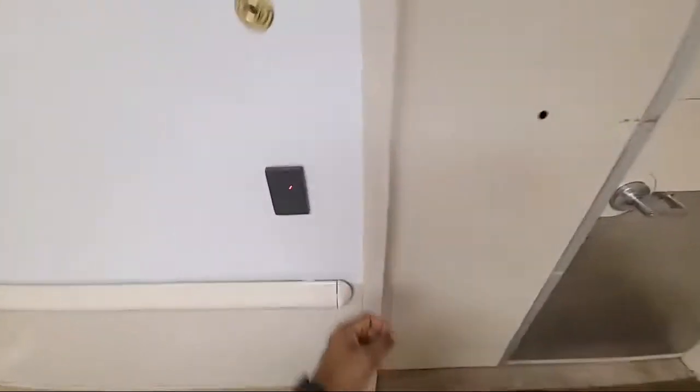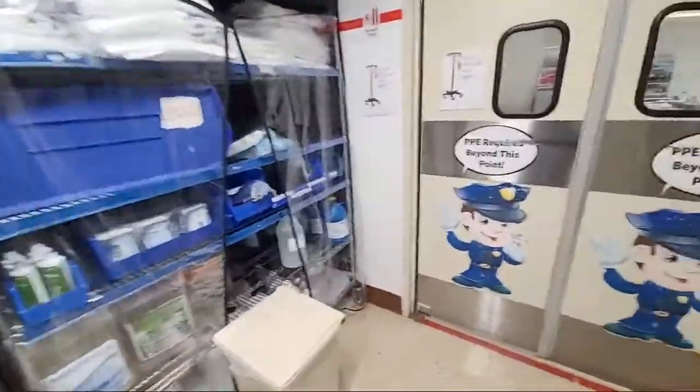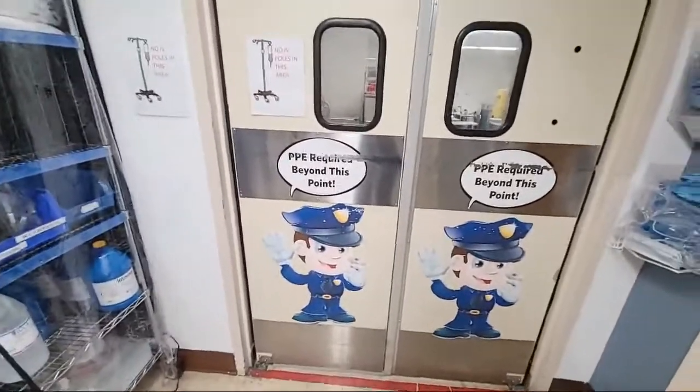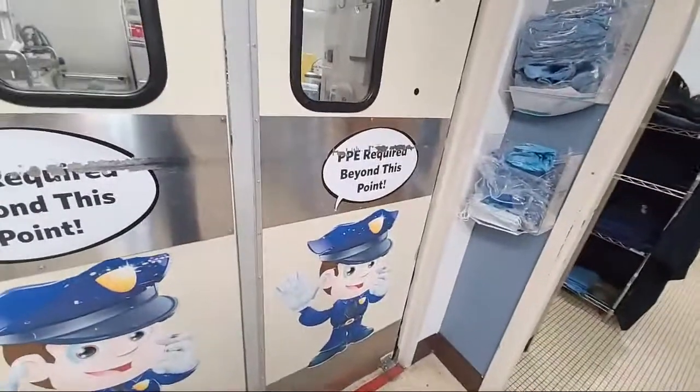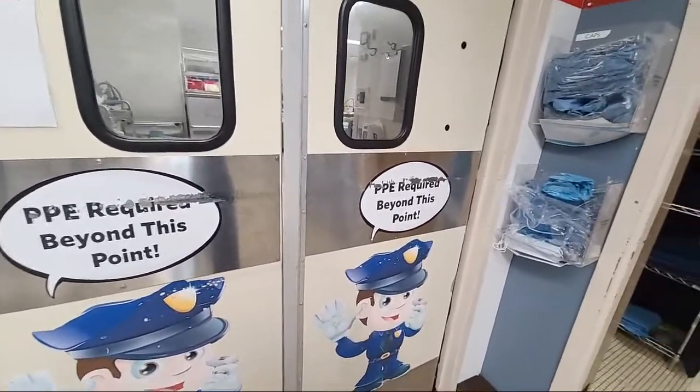Here we're entering decon. Okay, so we got to get our face mask and everything on. I have my thingy on. Let me get my mask on. And PPE beyond this point.